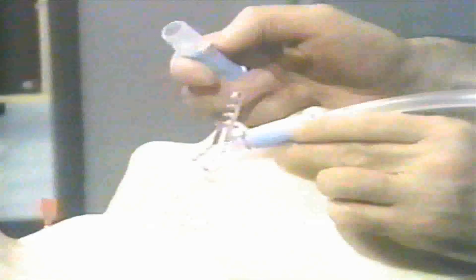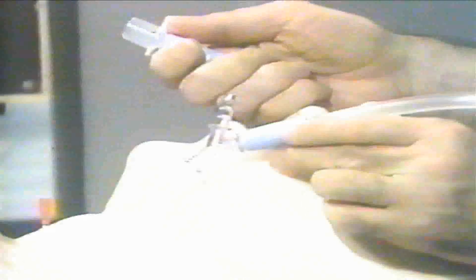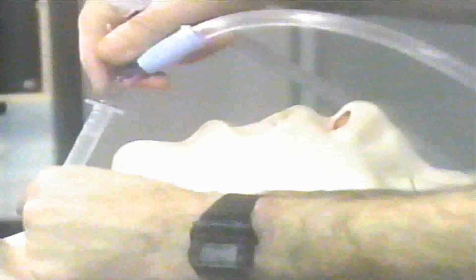A suction tubing is connected to this side, and the other end of the suction tubing can be connected to a regular connector of endotracheal tubes. This side is attached to the fresh gas flow of the anesthesia machine, and tracheal puncture is done as it was explained before, and this 2 cc syringe can be easily connected here.